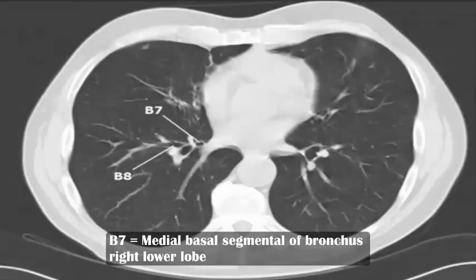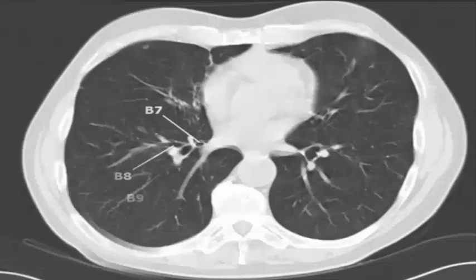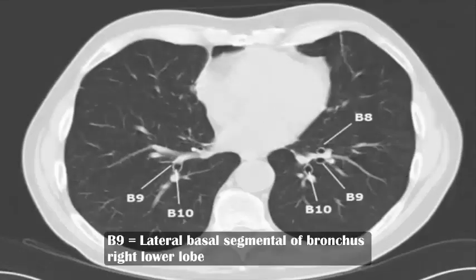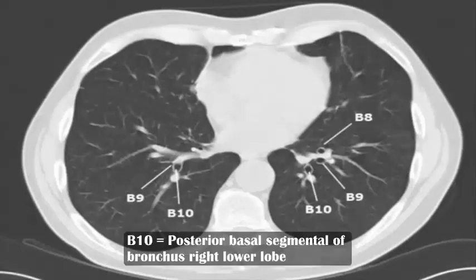B7 medial basal segment of bronchus right lower lobe, B8 anterior basal segment of bronchus right lower lobe, B9 lateral basal segment of bronchus right lower lobe, B10 posterior basal segment of bronchus right lower lobe.